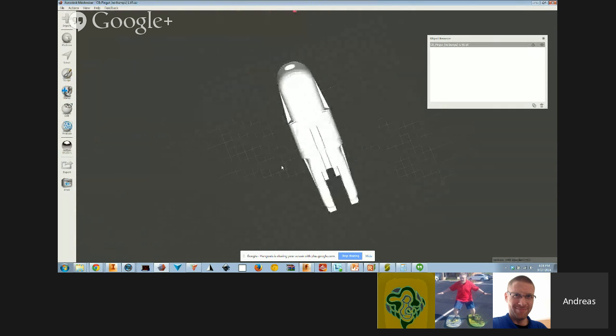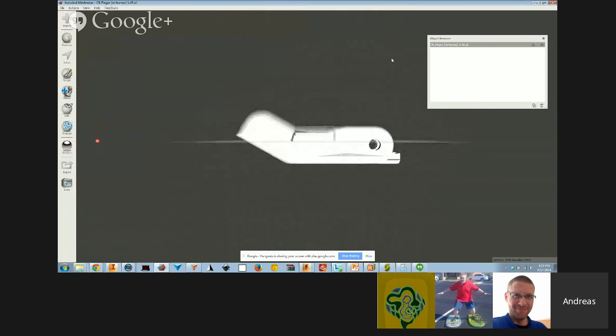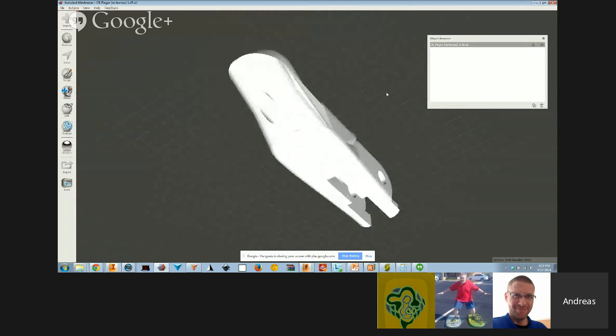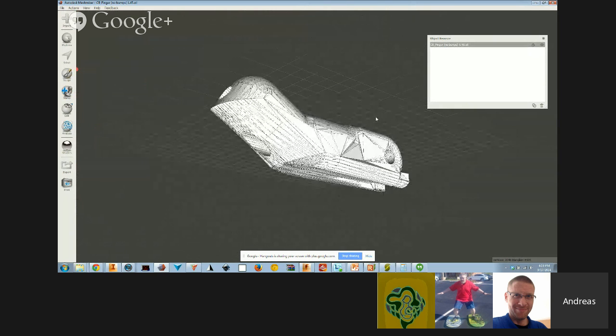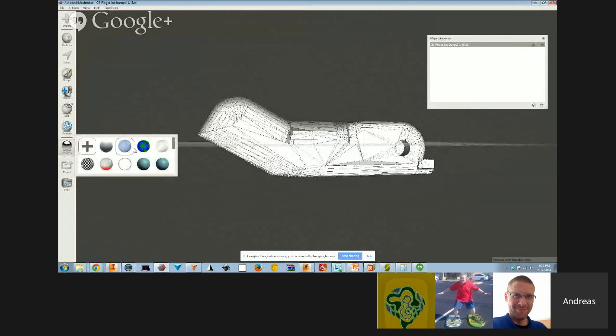So which way are we? Oh, there's the tip of the finger up here. Yeah, tip of the finger. This is print orientation. Good. Okay. Yeah, there's the print orientation with the flat bottom there. I can visualize this better with W. It's funny, your shaders look different than mine for some reason. Oh well, it's fine with me.